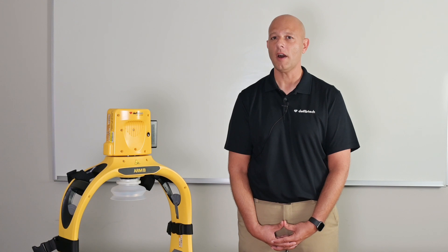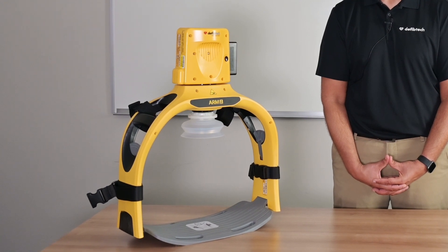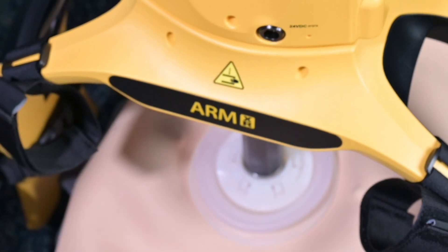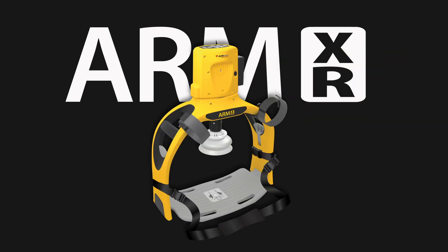Hi, I'm Mike Verespe, Clinical Specialist at DeFibTech. Mechanical chest compressors have become a standard part of the EMS toolkit for responding to cardiac arrest. These types of devices can tirelessly perform guideline-compliant depth and rate chest compressions. I'm here to walk you through how to operate the new ArmXR chest compression device.